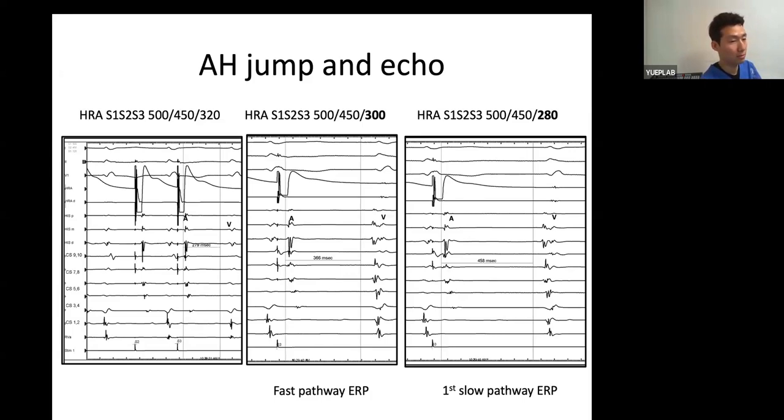But sometimes that does not work either, because this leftward extension is not necessarily close to the left side endocardium. We think left side because it's a closed endocardium. No, sometimes the leftward extension goes straight down to the middle of the septum, and comes down directly to the CS. Then you have to ablate inside the CS. So I think careful mapping is important. Number one, if this problem becomes that serious, I recommend putting in another decapolar catheter inside the CS, one on the roof, making sure that it touches the roof of the proximal CS. In other words, you need more detailed mapping of that area other than just one CS catheter. The reason being, in AVNRT, the CS also is quite larger than in normal people.